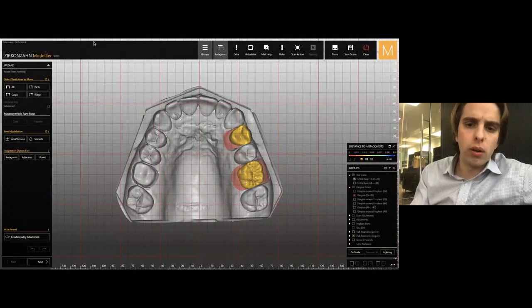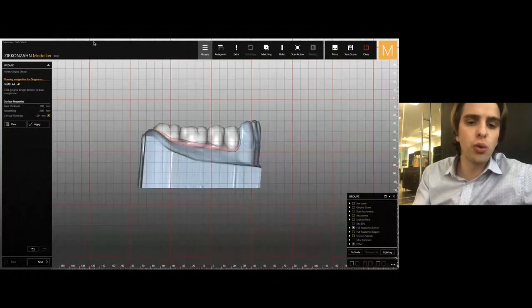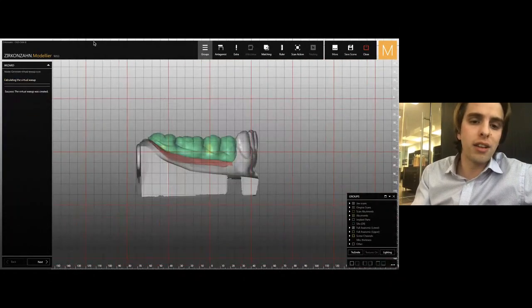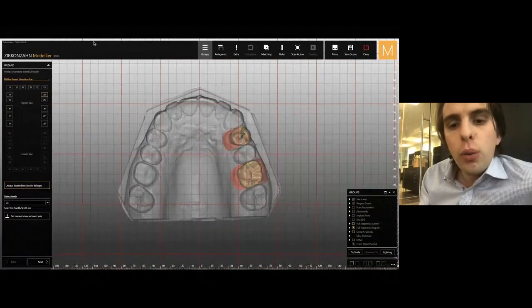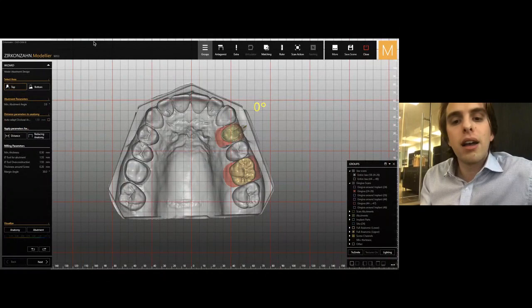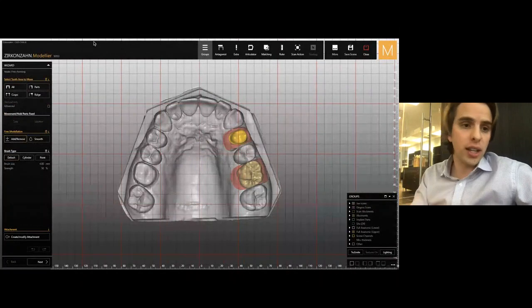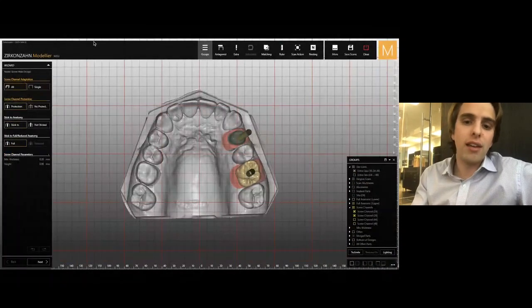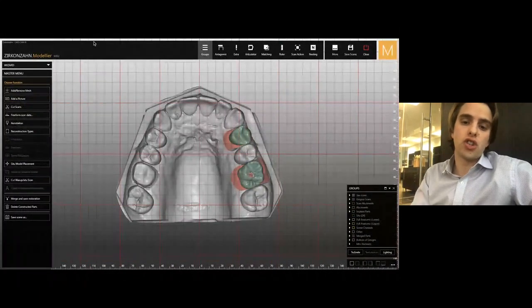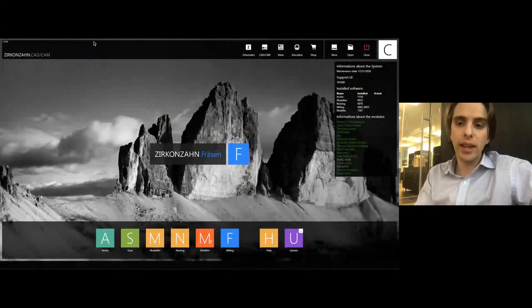We then will modify the tooth so we have the appropriate stop centrics. And on the lower jaw, we create the insertion direction, draw the virtual gingiva, create the virtual wax up, and we stamp out the screw channels. So the lower is done. And on the upper, we will then integrate the custom abutment design. And just like in the first course, we will have to set the insertion direction here, as well as the crown bottom parameters, and we save out the final reconstruction with the screw channels, bring this into the nesting software, position it, and go to milling.